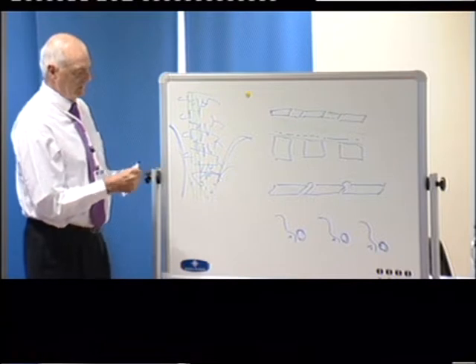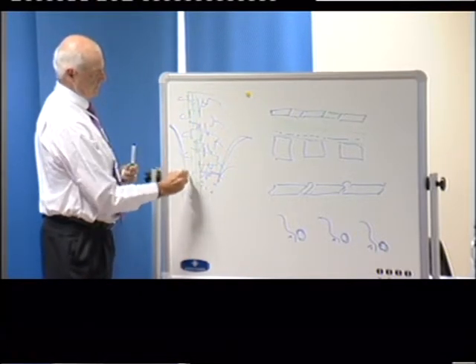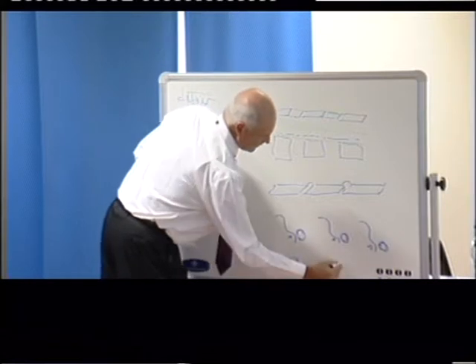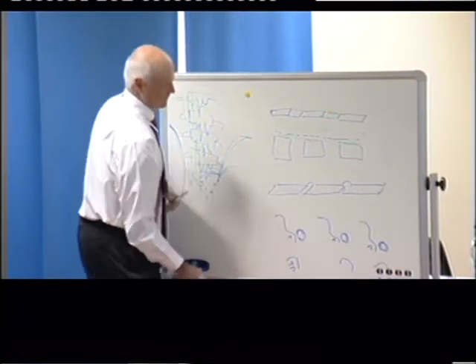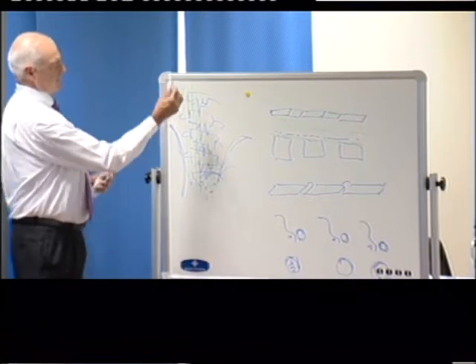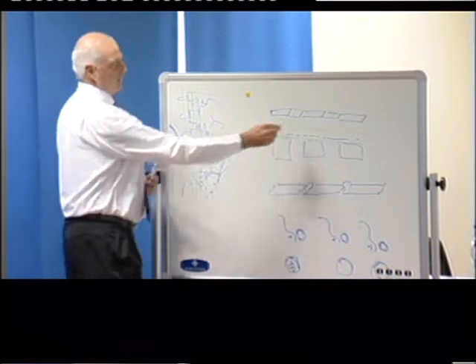And then the last slice is here. And that's going to be our transverse process. Questo è lo pezzo. So we'll go from lamina to lamina, which is spinal canal.